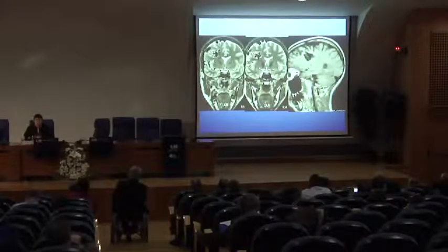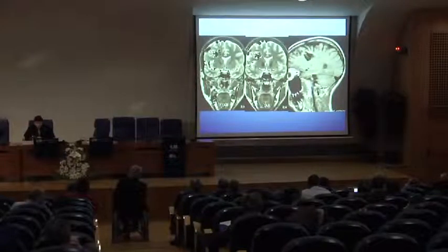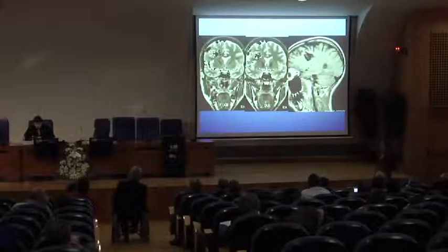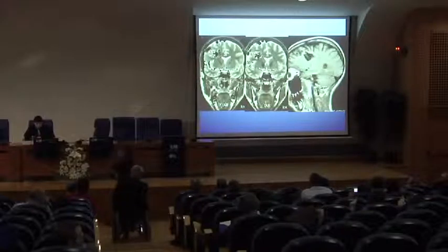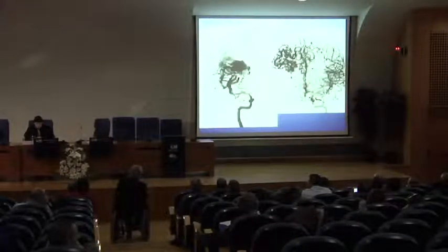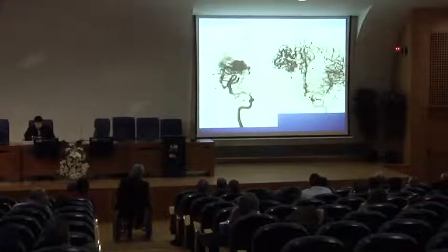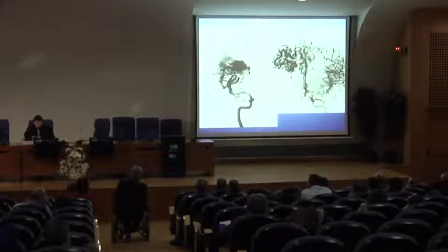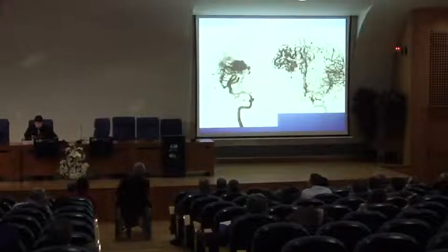In the beginning, when you study one AVM, you need to know the local anatomical localization of the nidus. This is a frontal AVM, cortico-subcortical, but the principal feeder, or the main feeder, is only the middle cerebral artery. The feeder that comes from the anterior cerebral artery is the collateral circulation. You know, in this part of the AVM, you also have the lenticulostriate artery.